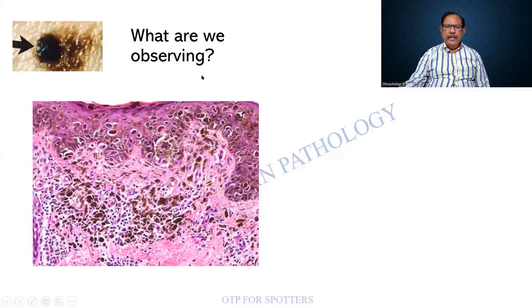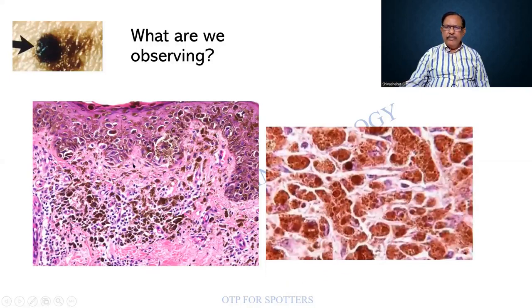What are you people seeing in this? So obviously there is a tumor. This is a skin. The wrinkles can be made out. The tumor is dark black in color, and I'm finding it becoming brown and pale. So this is the epidermis in which I'm finding large pigmented cells. It is all coming down into the dermis. So I'm able to see, but the nuclear details are not very clear. This is another slide that is showing coarse granules which are obscuring the nucleus.